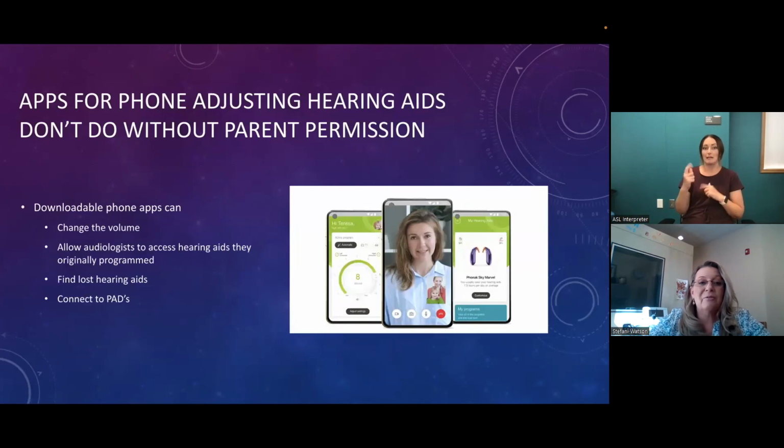Oh, this is really cool. We were talking about this earlier about the apps for adjusting the hearing aids. Some of my teachers have actually got permission from the parents to be the person in charge of the app for the student. We've got a couple of kids that have really bad sensory issues. So when it comes to lunchtime and other auditorium time, the teacher can use the phone to turn down the hearing aids.